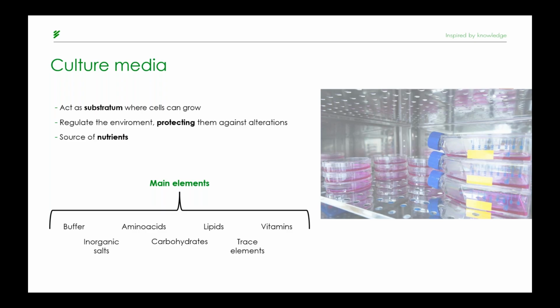Then we have the amino acids. They are the bricks of the proteins, and they are needed for growth and specifically for the synthesis of products. I want to highlight L-glutamine because this amino acid has a low chemical stability, so it decomposes rapidly in the media, and usually this amino acid is added just before the application.